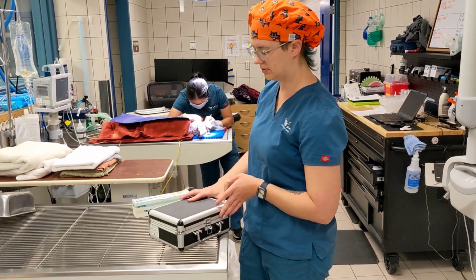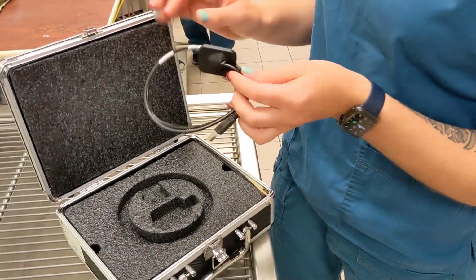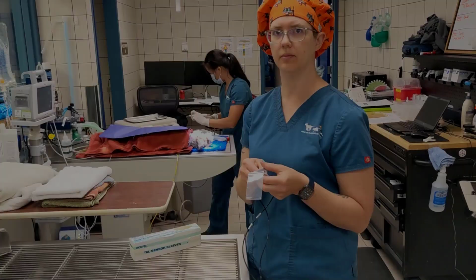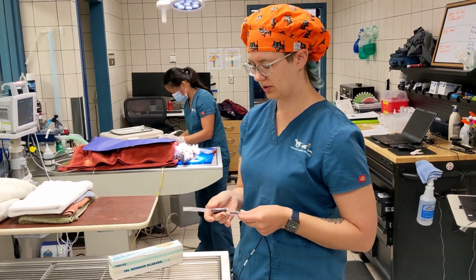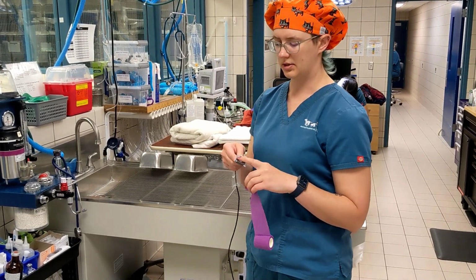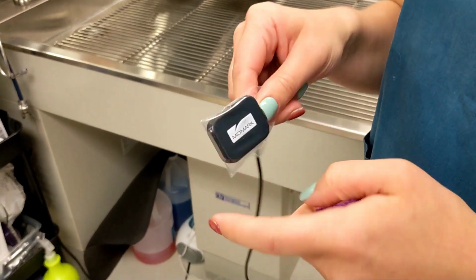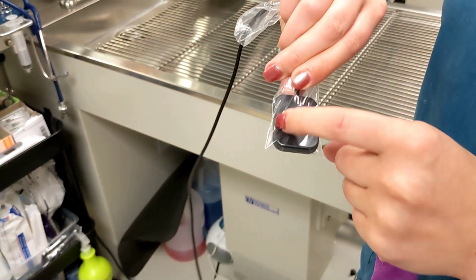The sensor is sensitive, so it is important to handle it with care and to store it properly when it is not in use so it does not get damaged. To prepare the sensor, slide a protective sleeve over it. You may use the sensor this way, or you may prefer to wrap the sensor in vet wrap for added grip within the mouth. Tiffany prefers to use vet wrap, so she is demonstrating how to wrap it here.